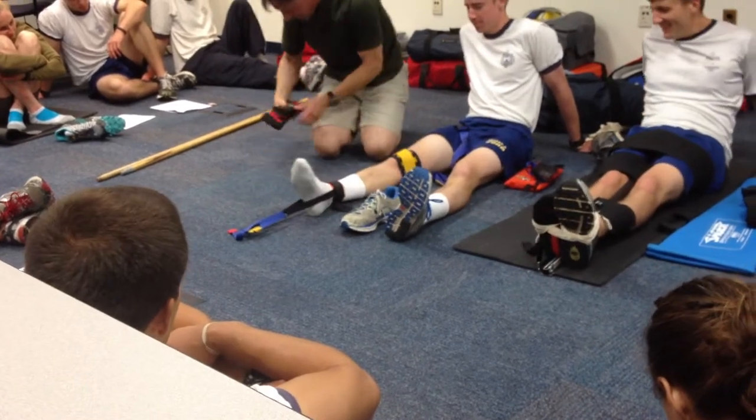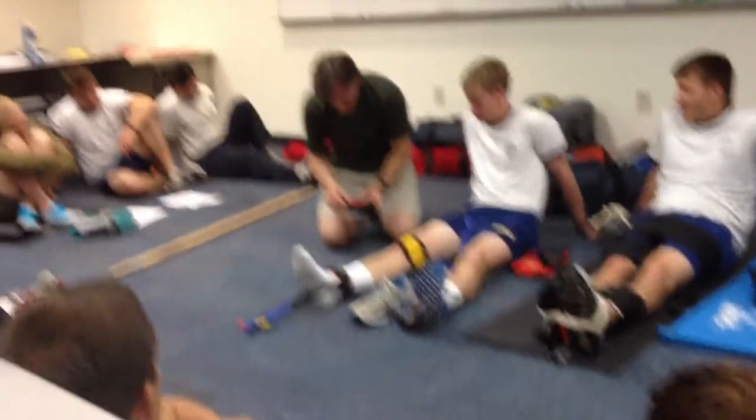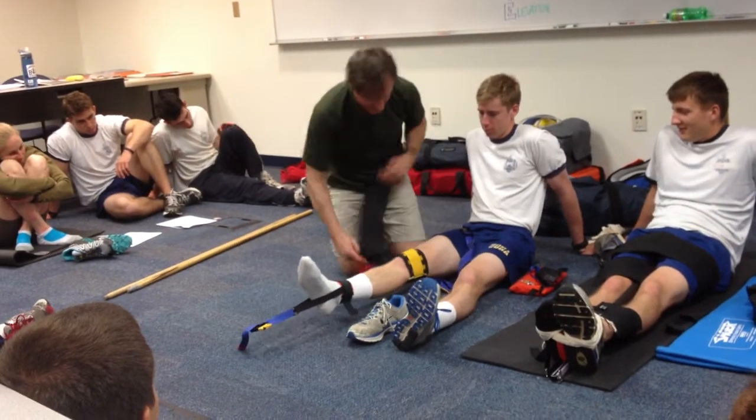We've got that on. We've got the pads. And again, at the end, we always check our CSMs again.